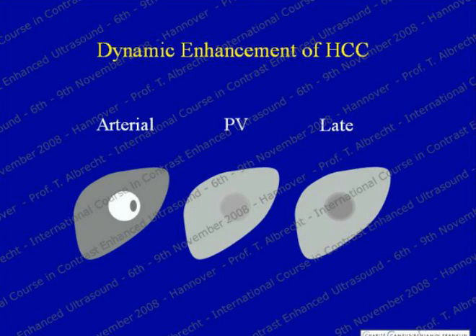We rely on the arterial phase, but again, Eddie's discussed this early on, and covering the entire liver during the arterial phase is exceedingly difficult. Not impossible, but difficult. The second reason is the liver in the cirrhotic patient, and obviously the vast majority of HCC occurs in patients who have either chronic active hepatitis or cirrhosis. These livers are abnormal and they're difficult to scan. They're heterogeneous, they attenuate, they're often enlarged, so penetration is a problem. So all these factors are against detecting HCC.